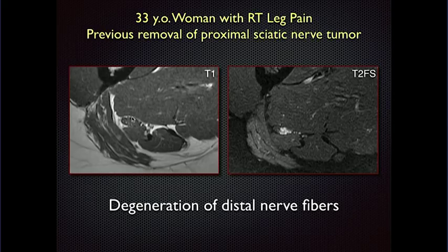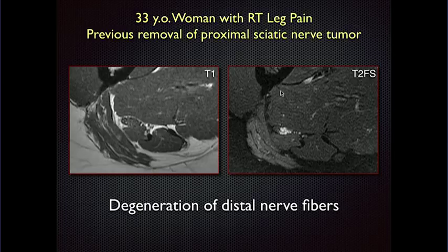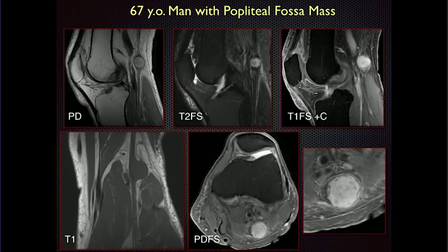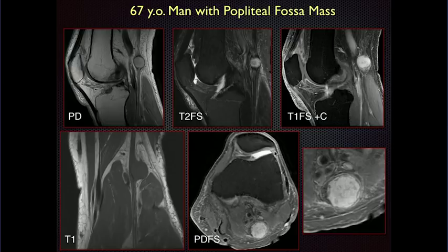Here's another case where if you map the nerve across to the T2 image, there are several fascicles that are abnormal — about half the nerve is hyperintense. This was a young woman who had a small benign nerve tumor removed upstream, and this is downstream degenerative change within the nerve. Nerve tumors are fairly common and obvious. When you identify a lesion along the course of a nerve, look specifically for that nerve. Here's a nice example of a tibial nerve with a neurogenic mass along its course.